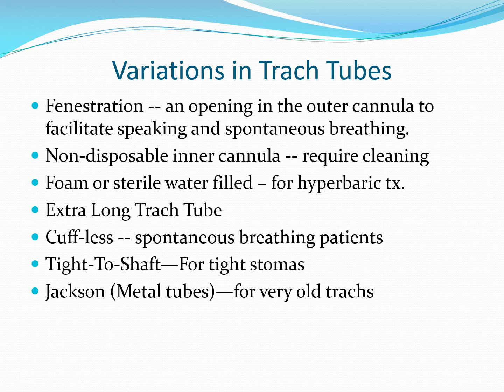Extra long trach tubes: they can be extra long front to back, or they can be extra long up and down. Okay, and it really depends on the patient's anatomy.